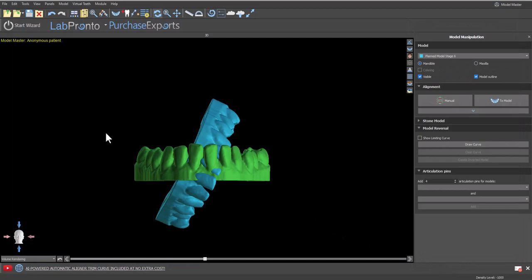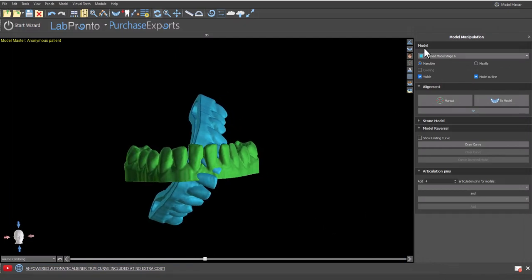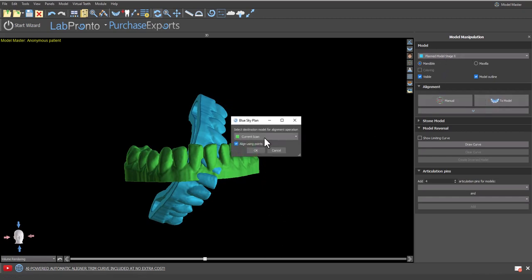We are going to actually skip this alignment stage because we want to align this model to the original imported model. And once we've skipped the alignment stage, we're going to make sure that the relevant model is selected from the drop down list and click alignment to model. Confirm that the original model selected from the drop down list. Make sure align using points is activated and go ahead and click on ok.